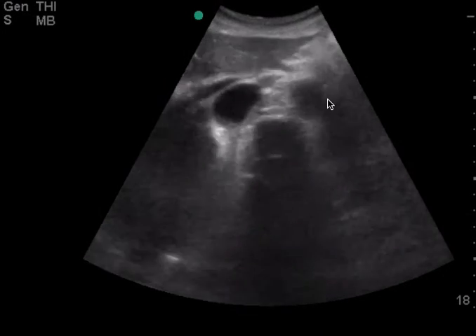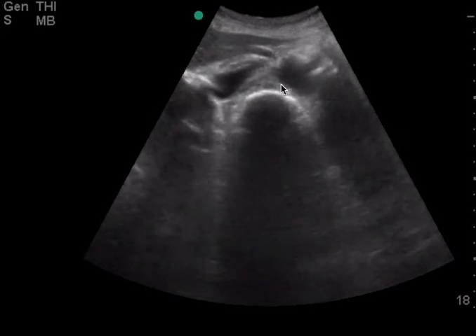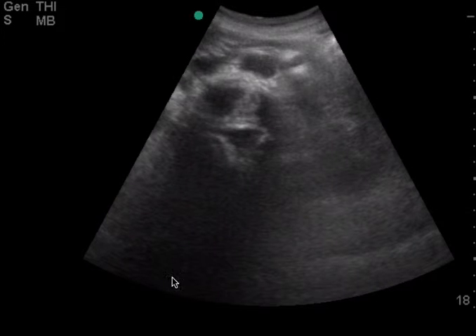This is your descending aorta. As you're going down, you can see the branches come off. One thing to point out — you see all of this here, this is all unnecessary space. Clearly, this woman is quite skinny, since from her skin to her spine is maybe three or four centimeters. So you don't need all this space here — you can decrease your depth a little bit.